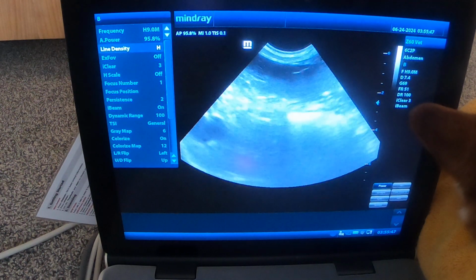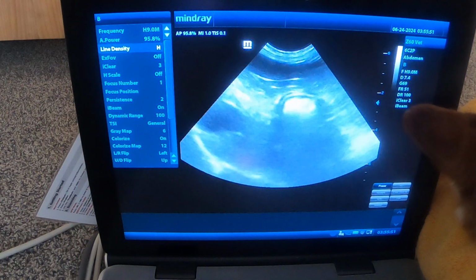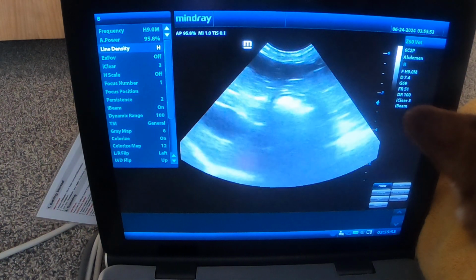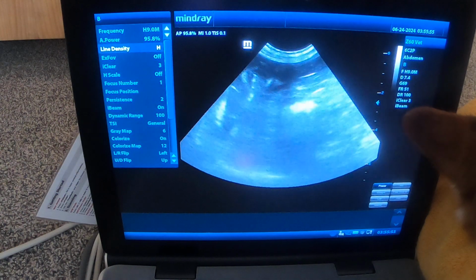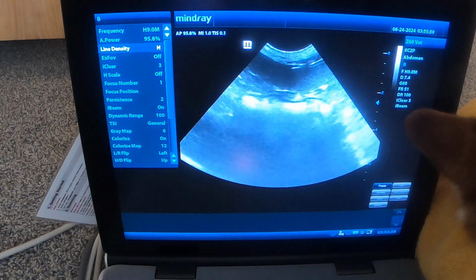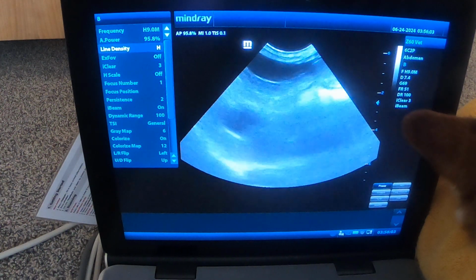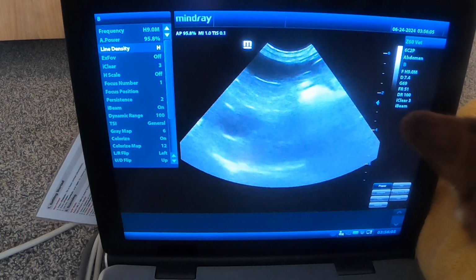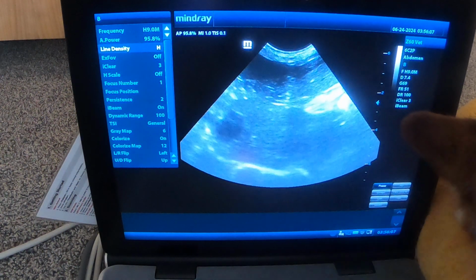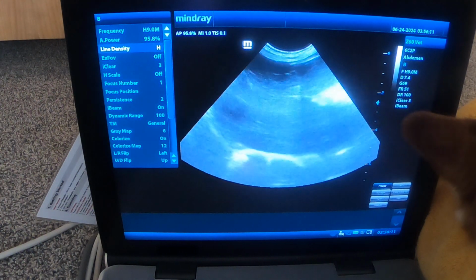All right, looks great, everybody. There's stomach again. Here, see stomach going up. You can probably follow it and even try to find pylorus and stuff too, but we'll cover that when we actually start looking at all our different organs. Gallbladder again. There's a kind of DH view, right? Gallbladder kissing the diaphragm. There's our hyperechoic line of the diaphragm kind of sitting in the far field. And the diaphragm just kissing.